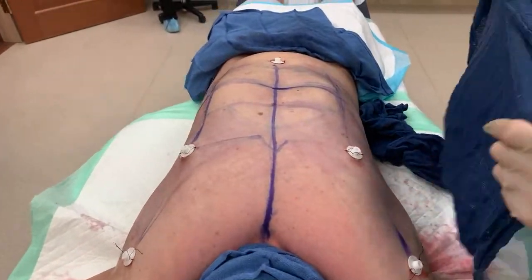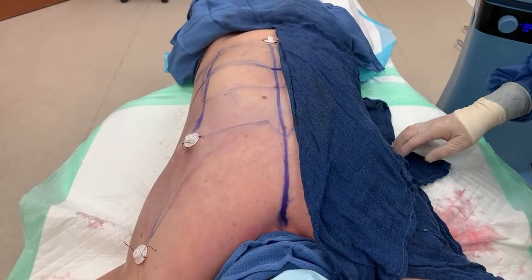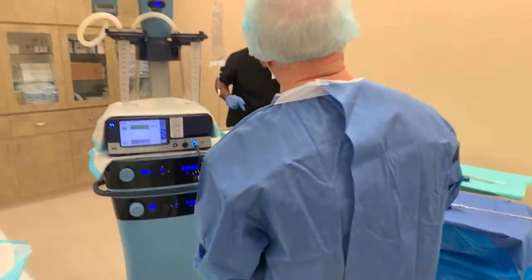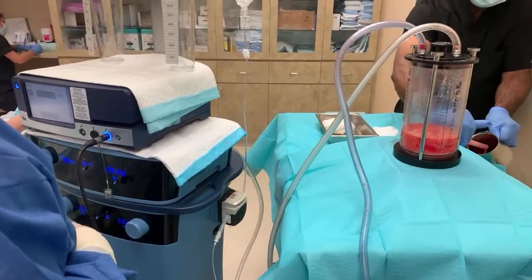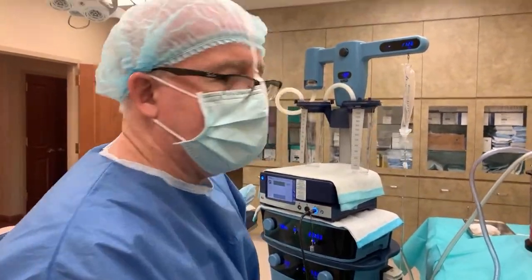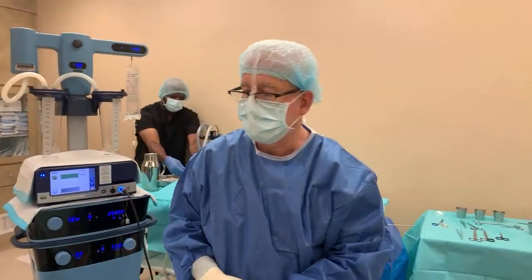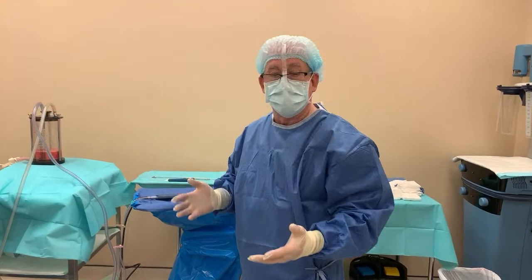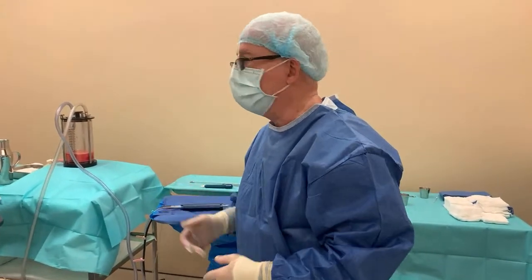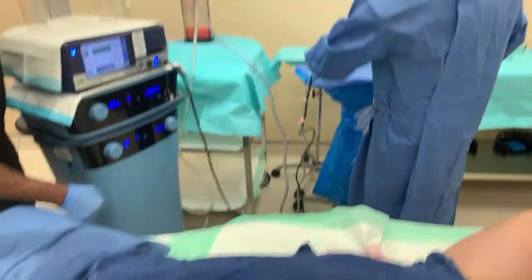So we're at 17 and we're going down to maybe 500 — make it even. Charles Turner wants to know how much. I don't discuss prices publicly, Charles — you call me up and we'll discuss it. Everybody's different. If you weigh 240 pounds it's more money than if you weigh 195. It's all about what you want and what I give you. This guy is being amazing, so I'm giving him the six-pack for free because he's laying here not giving us trouble. We went from 17 down to 500.